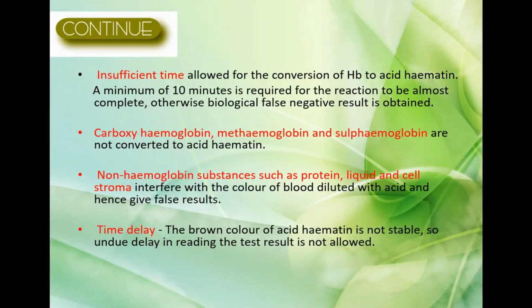The hemoglobin value which we are calculating is only for the normal hemoglobin molecule, not for any of the other hemoglobin molecules, right?